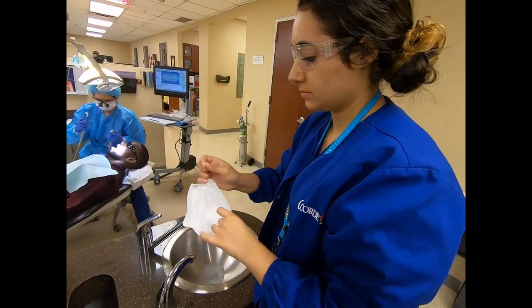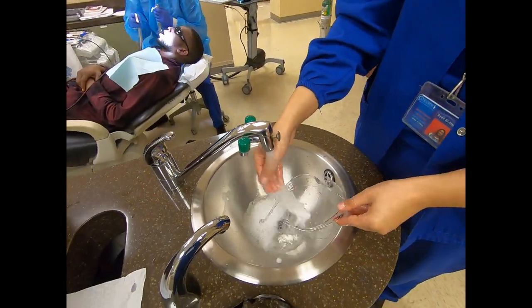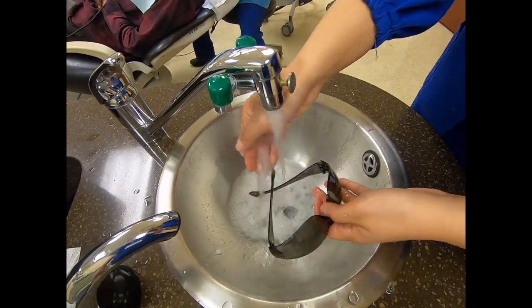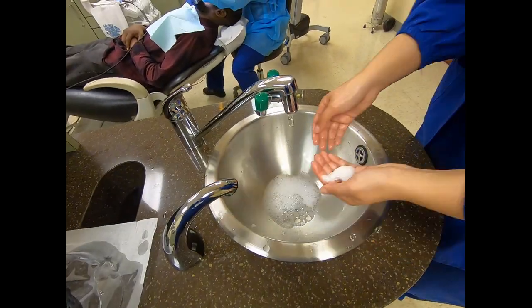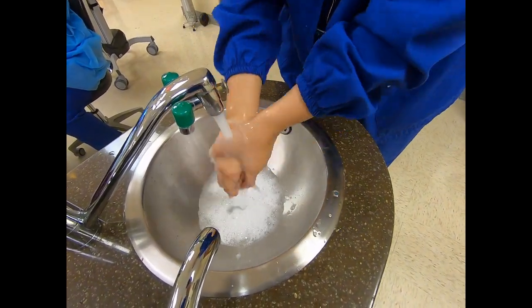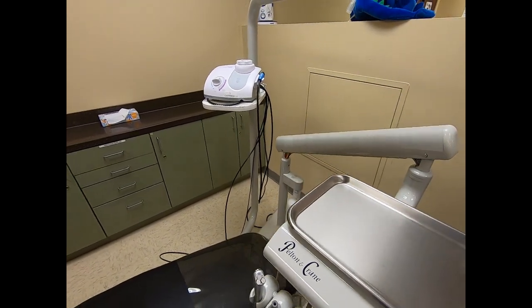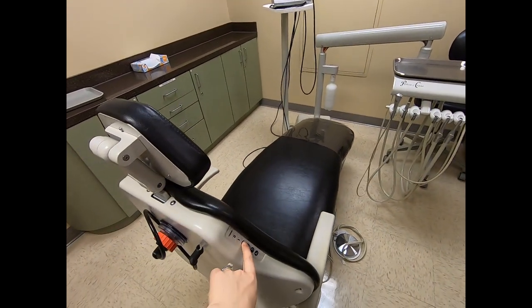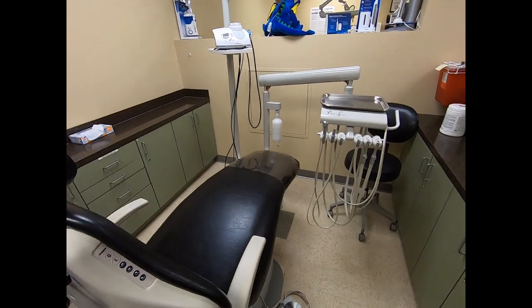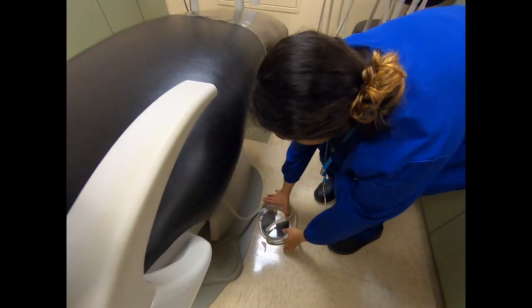Remove your mask and goggles and wash the goggles with soap and water and lay on a paper towel to dry. Wash your hands per WHO and the room should be adjusted to its original layout, so place the bracket tray in its original place, raise the chair, and adjust the light. Then place the rheostat back on the end of the chair. This will complete the hand washing, PPE, and operatory skill assessment.